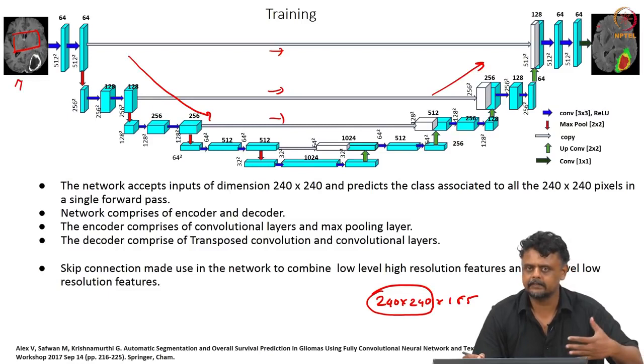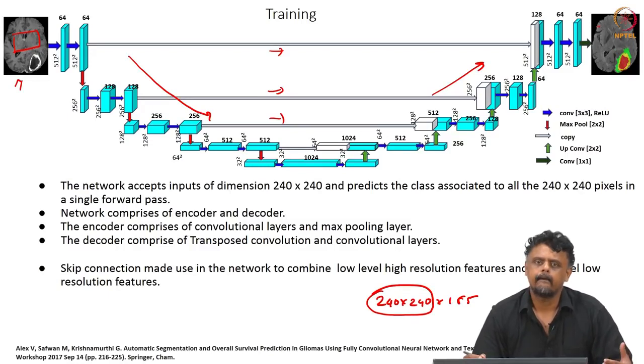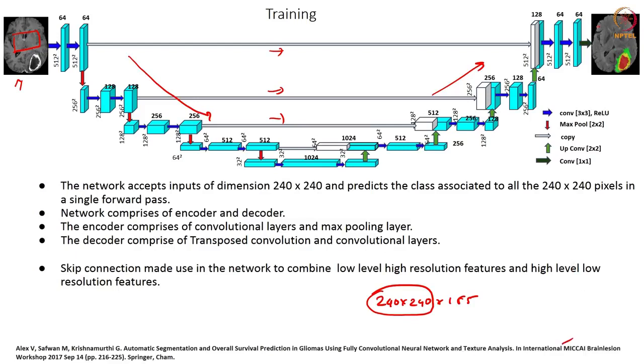The successive slices as you go through the volume are correlated, so it is good to exploit that correlation. And within a slice, if you look at one cross section, that is one slice that is shown right here, there is not much information about what this class is. At the edges of the image you are losing out, because the neighborhood information is missing, since you are close to the edge of the image.